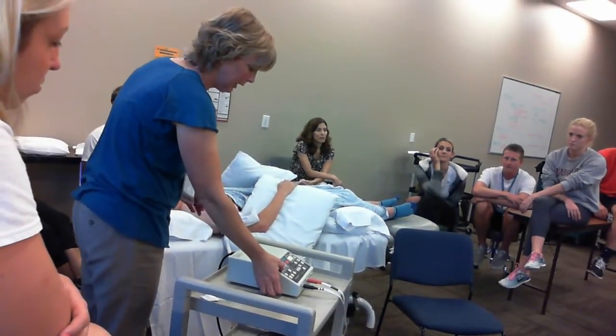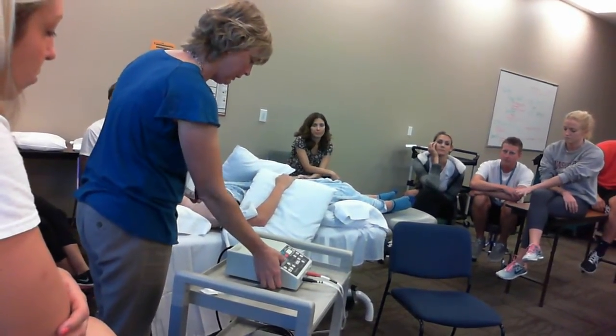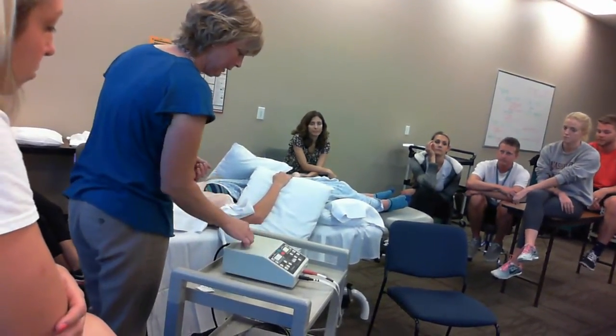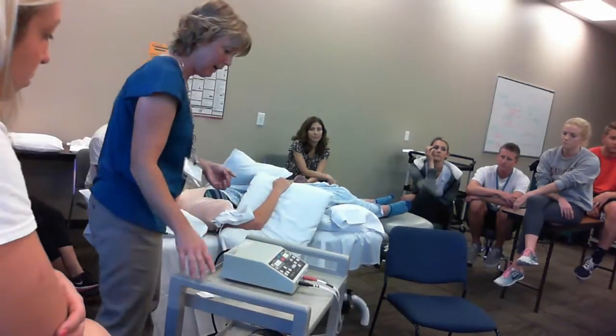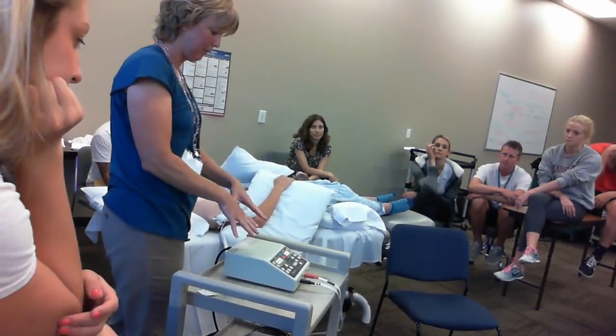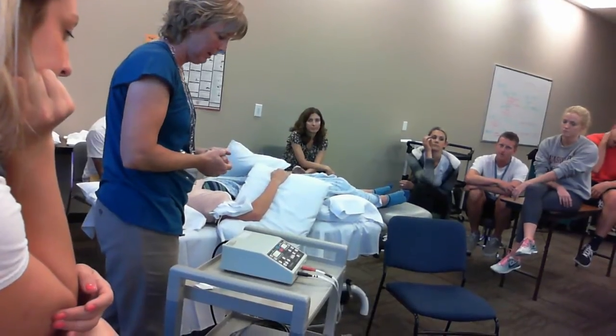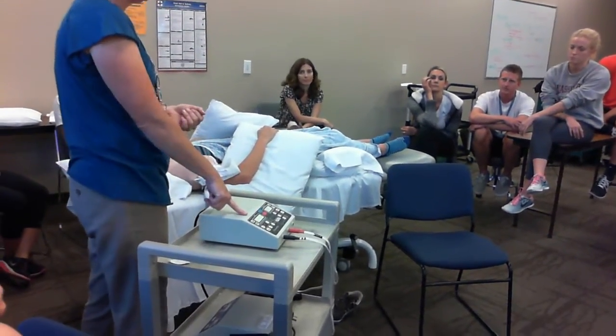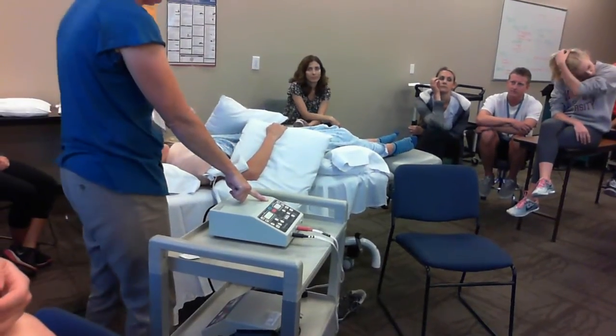Okay, so Lily, I'm going to go ahead and turn the unit on now, get the current running. Is that okay? Great, so you're going to feel that little tingling sensation. Just let me know when you first feel it. Now I have to wait for my menu. It still says 80 to 150 and then it'll switch back. There we go. So it says 15 minutes again and my intensity is over here.